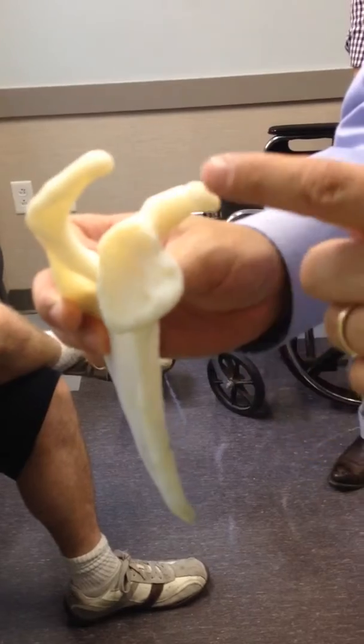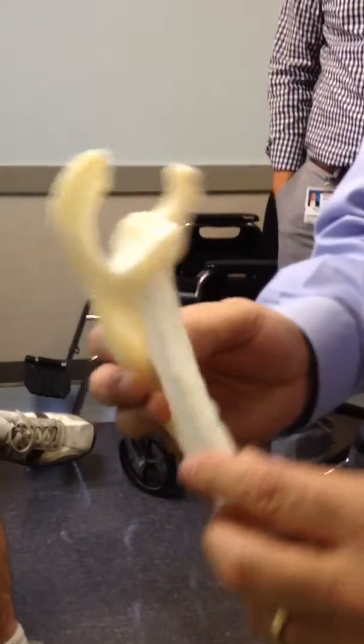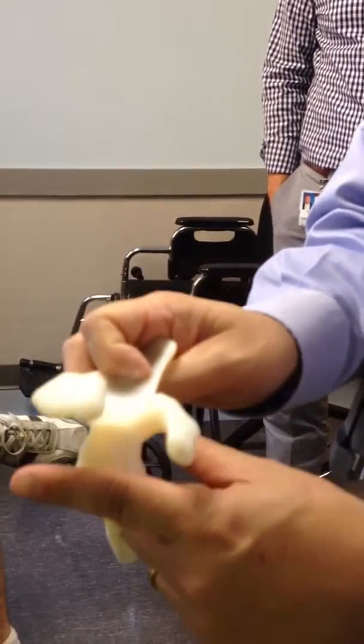Catherine, this is your socket. The back of your socket, here's the front. The back of your socket was completely worn. You can see in this plane, it should be like this.